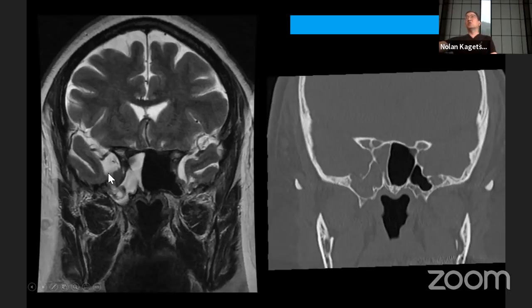And so this patient actually has temporal lobe that has kind of gone through a bony defect. So we call this encephalocele, because there's brain that's kind of where it's not supposed to be. And it looks like on the other side, there's a smaller encephalocele and a bony defect. So this patient had a congenital defect of the bone, and over time, brain has pushed through that defect, and you have CSF.